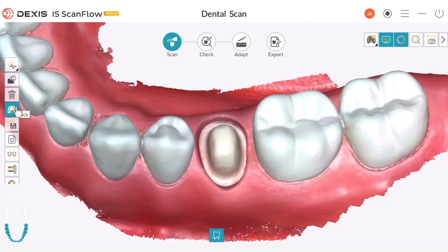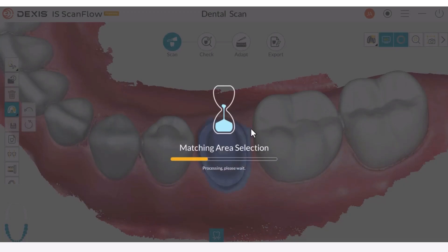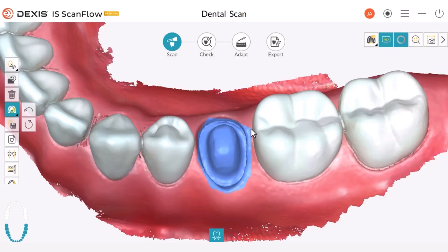Let's see this process one more time. First we engage the lock option, then we select the whole area, and we double click when we finish. Now this area is locked. If we are going to start scanning again, the scanner will not scan anything that is on top of this area, like fingers or anything else.